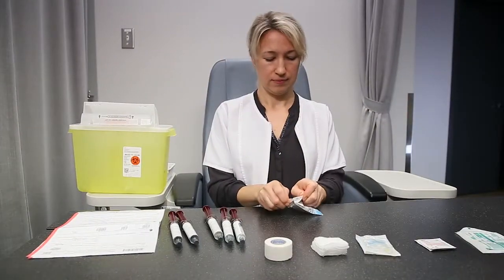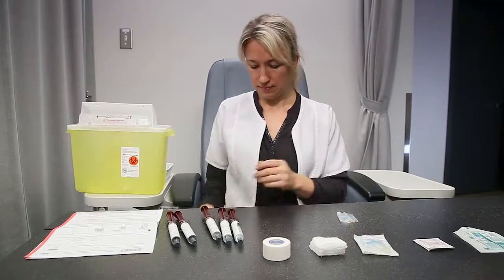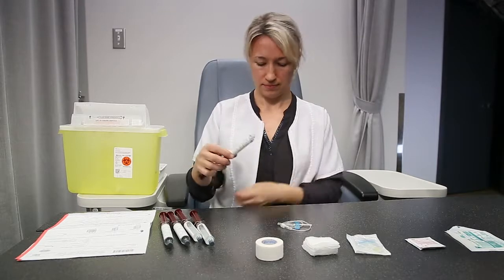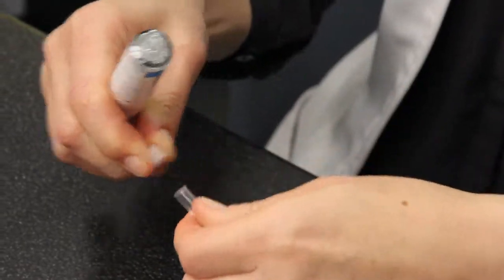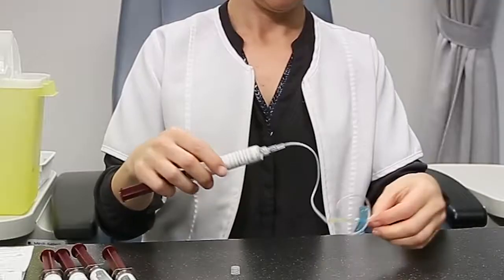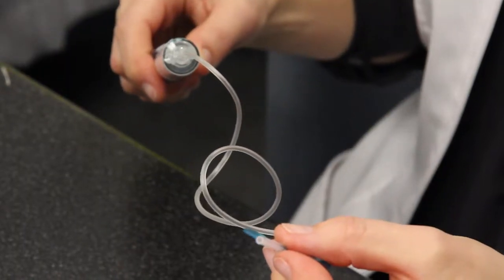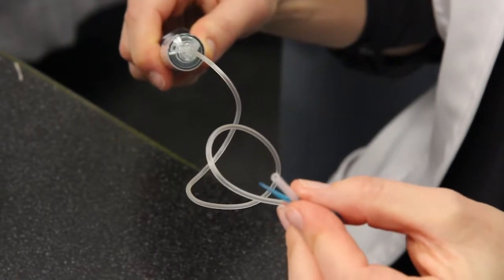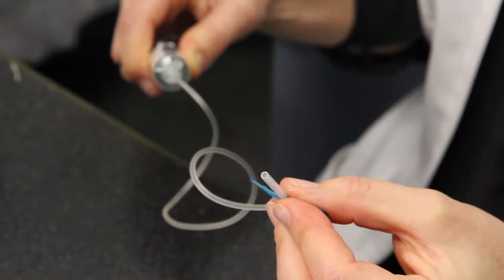Open the package containing the butterfly needle with the attached tubing. Attach the syringe to the butterfly needle extension. Remove the covers on the extension and the syringe and attach by twisting clockwise. Do so in an aseptic fashion. Prime the tubing by pushing on the syringe plunger. The plunger can be stiff at first, so do not hesitate to exert a push and pull motion to free the plunger.